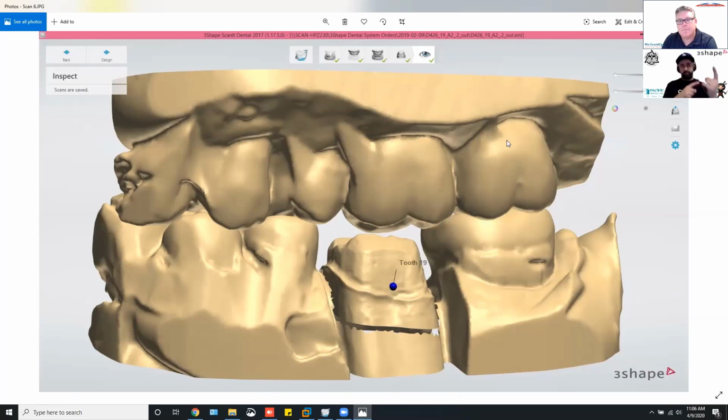So it's constantly a little bit back and forth, but yeah, it constantly keeps it going. And if you only have one scanner, it wouldn't hurt to order 2 more extra plates just for the next case for the model and the posing, and you can actually get the next case ready in line and that's ready to scan.